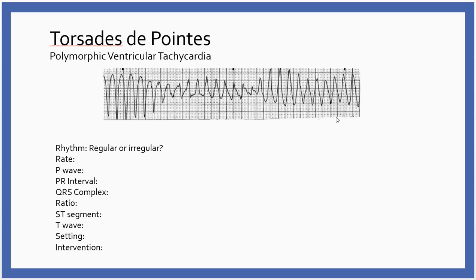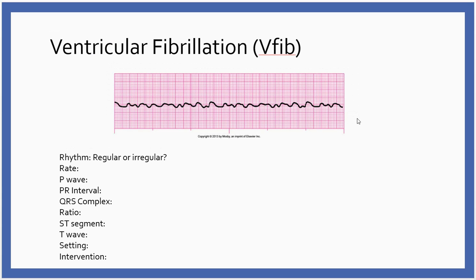We don't like to see this. VFib, well, we really don't like to see this. So you see this on the monitor, you still have to check your patient. Annie, are you okay? If they open their eyes and say, what's up with you? Well, they're not in VFib. Chances are good there's a lead off. So Annie, are you okay? And if Annie's not responsive, then you're going to go ahead and start your chest compressions.